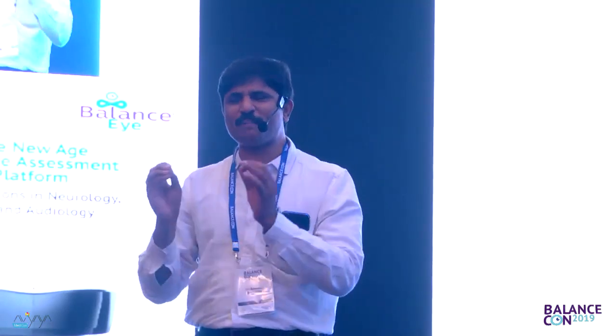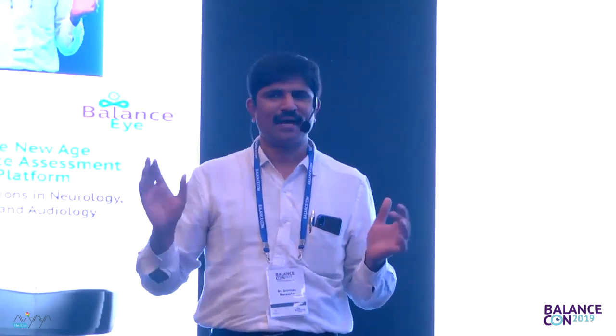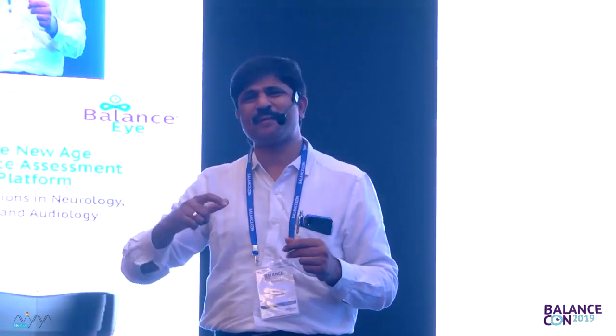Correct? Shall we now look at one particular index beautiful patient case and look at the nystagmus and tell what is happening to the inner ear fluid movement? That will be instructive, and will become a strong foundation for us to start interpreting every other positional maneuver. Shall we embark on this short journey?